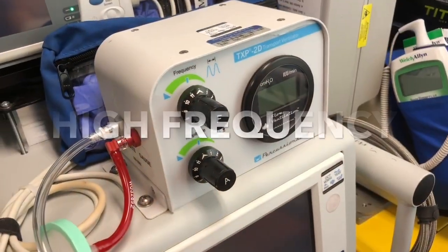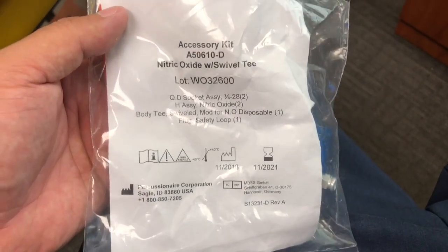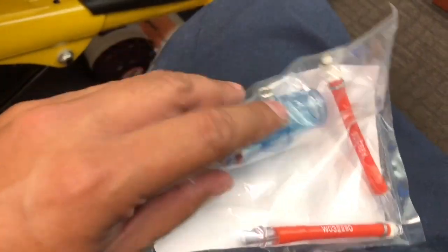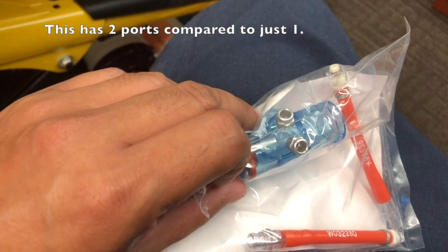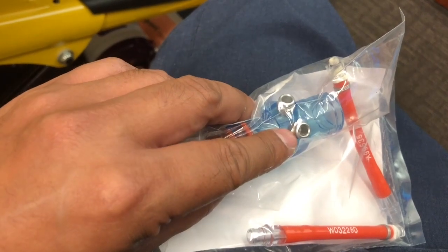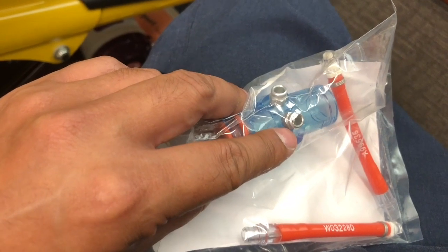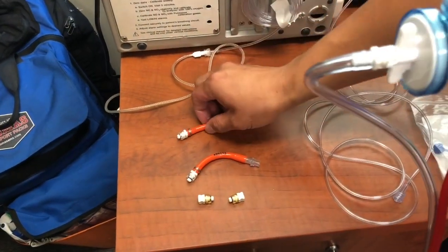We're going to show you our high-frequency setup first, after you've connected the Broncotron circuit. Inside your Broncotron circuit, you'll notice this kit — this is your accessory kit for nitric. It has two red lines. The difference is these two things here compared to only having one on the regular Broncotron circuit. You're going to hook up one of those red lines, and that's where you're going to sample your nitric. Once you've located those two red lines, go ahead and connect them.